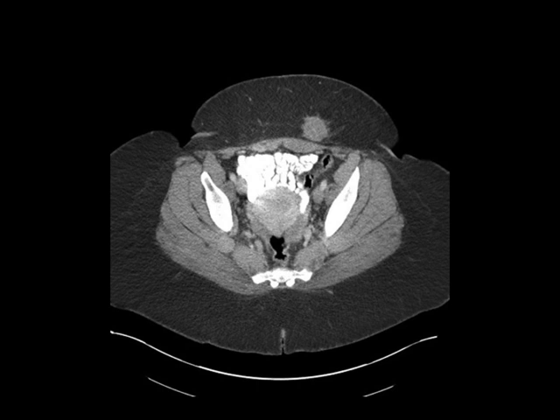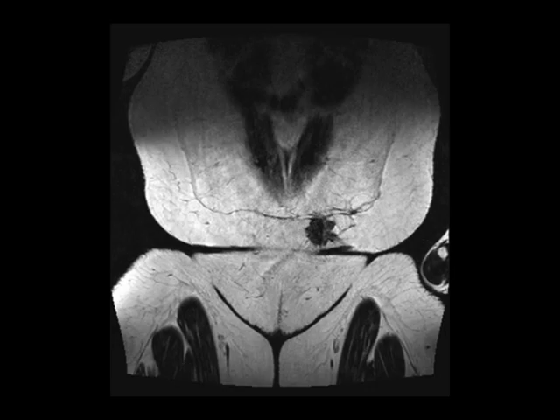So usually these lesions look solid, they're T1 dark, T2 bright — unless you have some hemorrhage which can alter the signal characteristics — and they're often going to show moderate to marked enhancement.